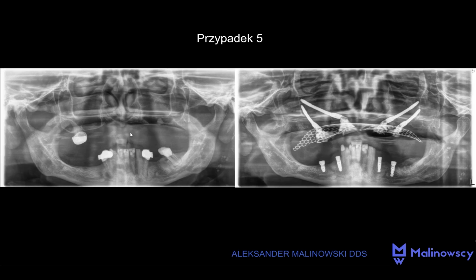Okay, as you can see here in the panoramic images, the patient suffered from extensive atrophy of the maxillary alveolar process. For this reason, I could not opt for traditional implantological procedures. Such atrophies are not suitable for therapy through bone regeneration. Hence the decision to use the zygomatic implants.